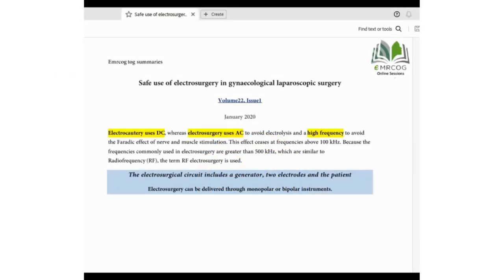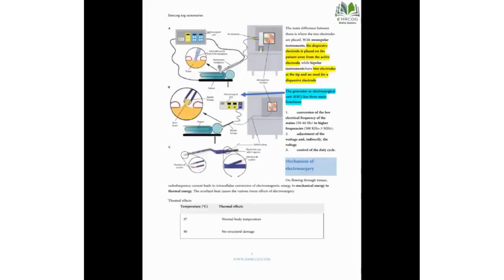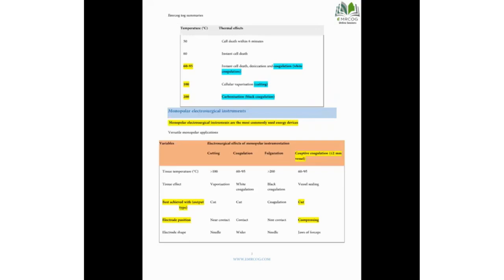We have several types of injury due to electrosurgery. The most common one of them is the direct application, because of the lateral thermal spread. This is something that has nothing to do with coupling. Coupling means some of the energy from the electrodes has transferred to somewhere else. Okay, not a thermal spread.